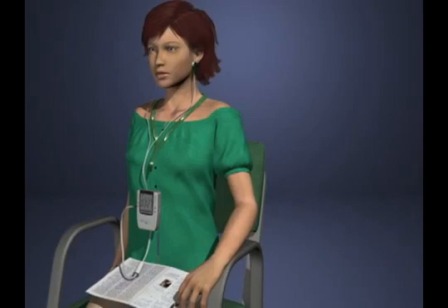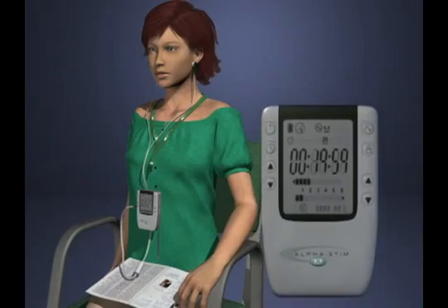Relax, sit or lie down, and let the Alpha-Stim M relax you. You may also read, work at a desk, or watch television. Do not attempt to drive or operate dangerous tools or machinery during treatment. Always complete a cranial electrotherapy stimulation session.